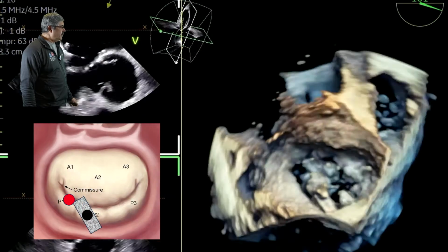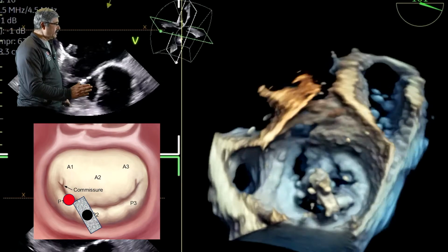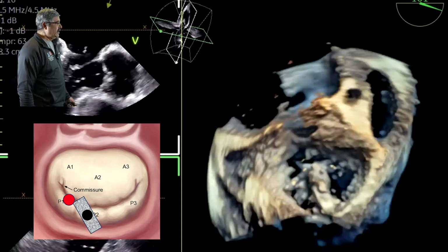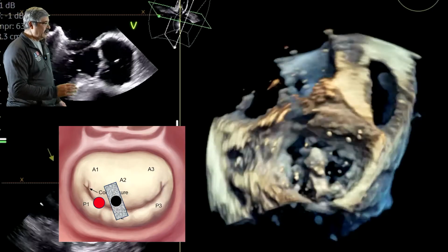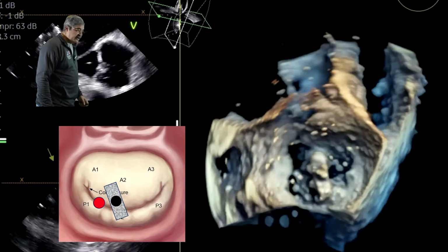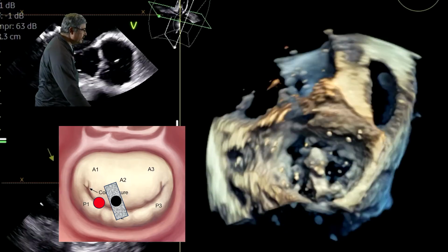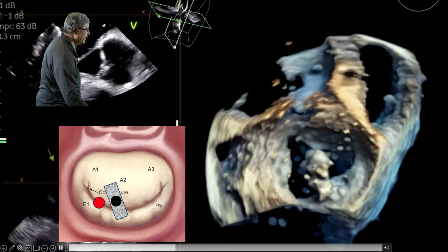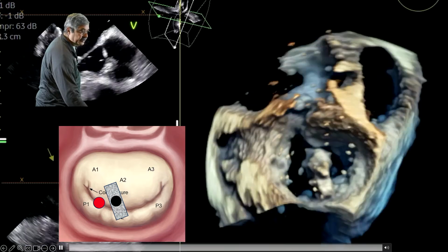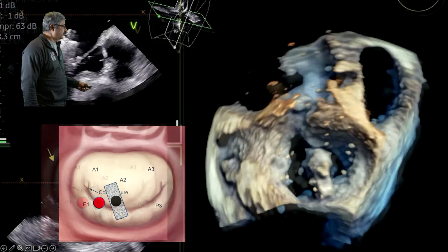Now we want to ask them to move a little bit, rotate clockwise, move anteriorly, and a little bit more medially. And they are doing it as we look along. Now, as you can see, they've straightened the clip, but you can see that there's still the flail segment visible right below the clip. So it's not exactly on top of that segment.